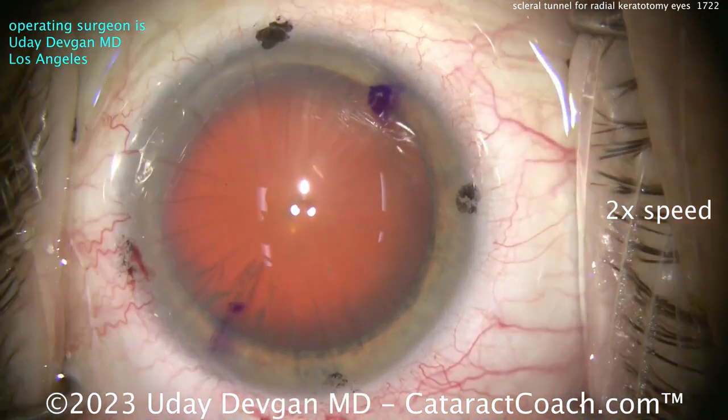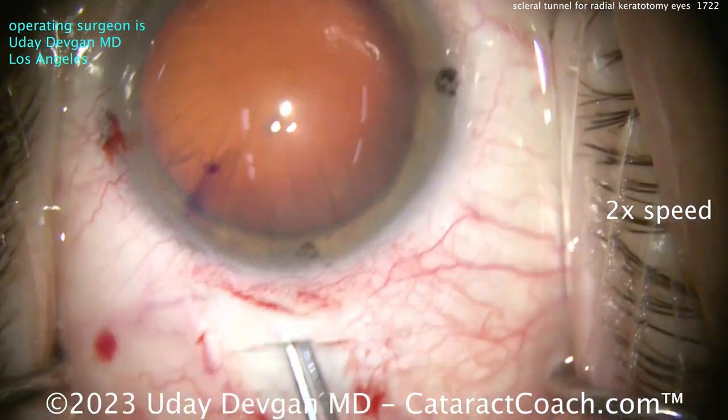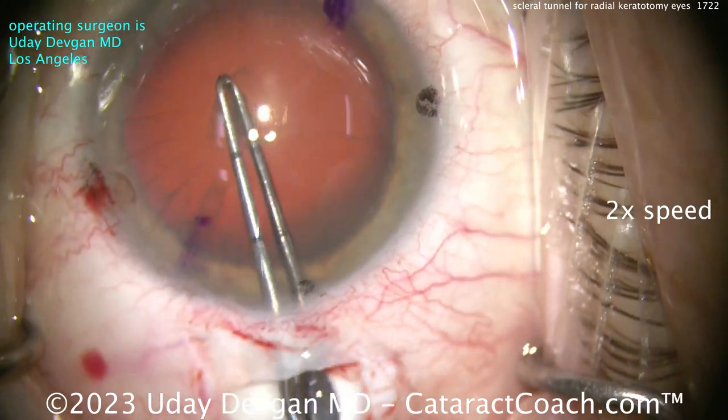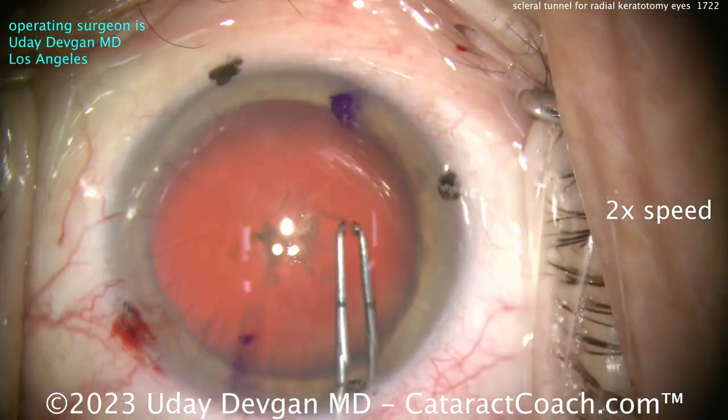So that's our scleral tunnel incision for the surgery — you definitely need to learn how to do that. Now we'll get our capsulorhexis done. You can see this is the easy part of the surgery — good red reflex here.